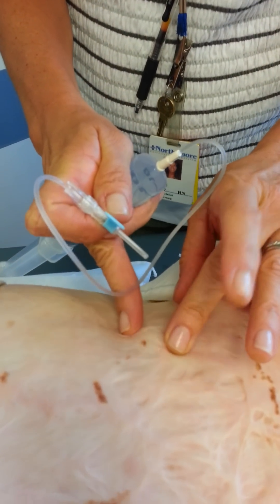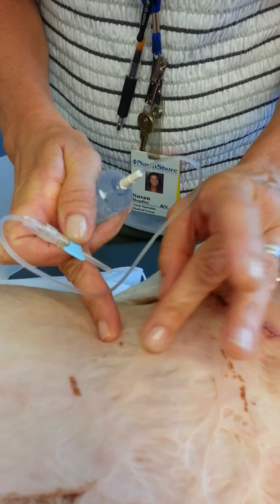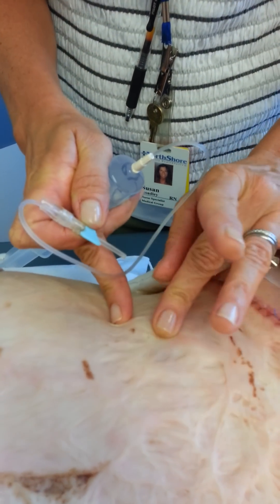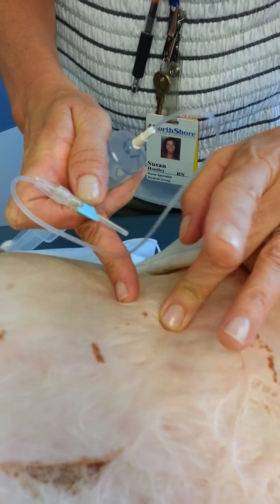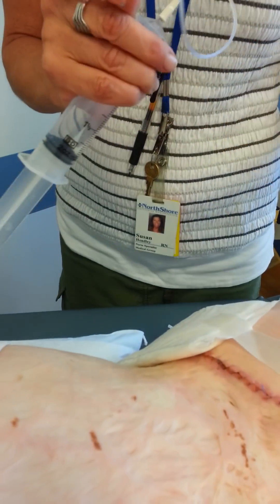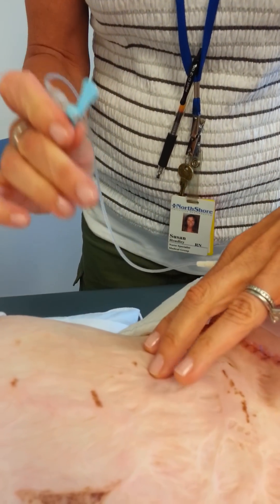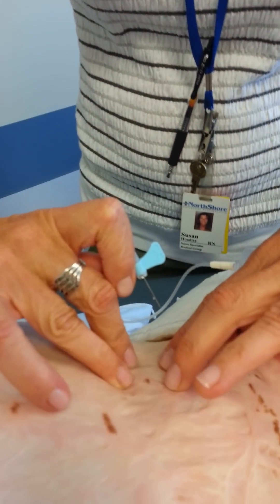We've already sterilized this. I'm just going to find my landmarks one more time, which I can feel — not touching the top of the portware, which is cleaned. So I could go anywhere in between there. Take my needle cap off, come back again, just feel those margins of that.